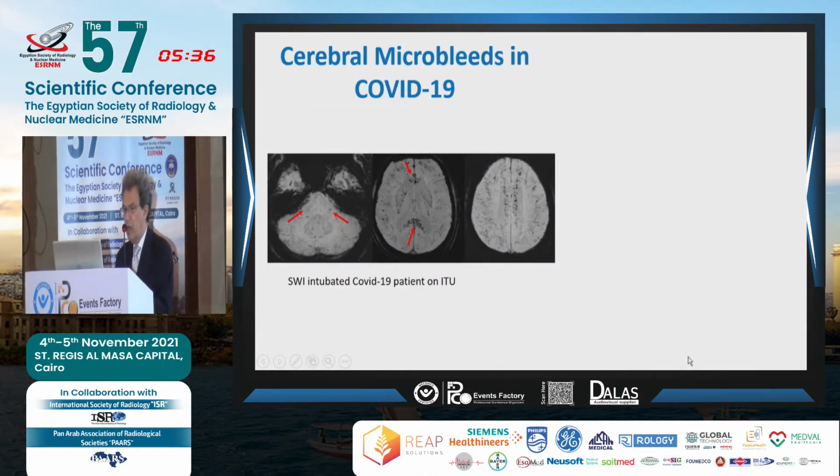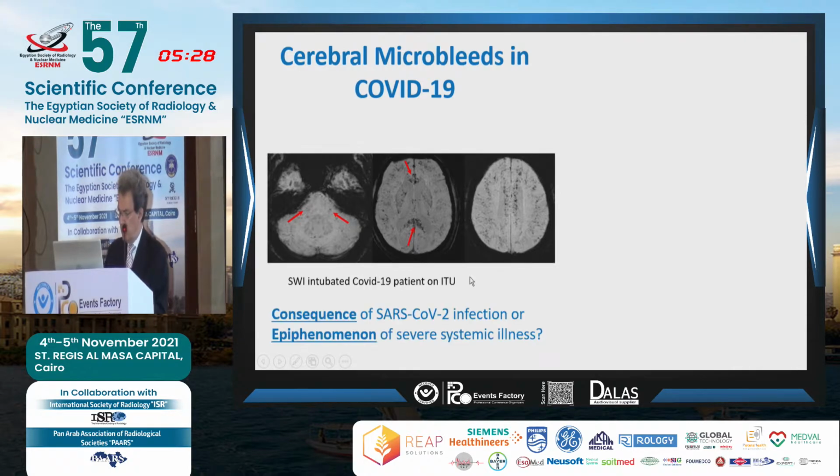So the cerebral microbleeds are actually quite interesting, and you can see them quite extensive on this patient who was intubated and was on ITU. The French team was quite, I wouldn't say aggressive, but quite easy going with performing an MR. In our institution, our anesthesiologists and critical care doctors were not that keen on transporting a patient who was clinically quite critically ill to our department. But, you know, it gave us a wealth of data. And you see here the changes, especially in the corpus callosum, in the genu, and in the splenium.